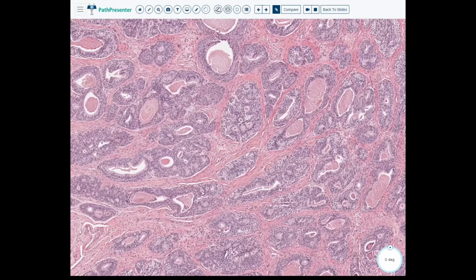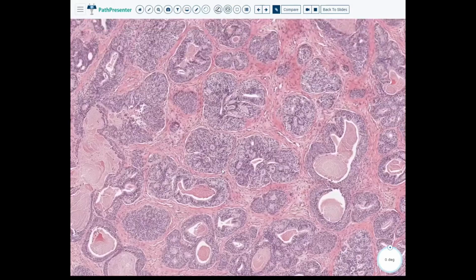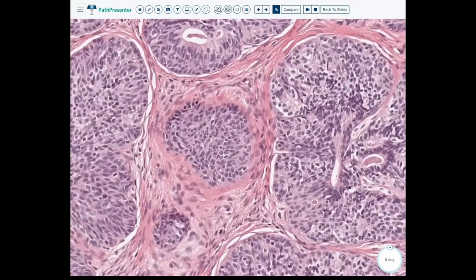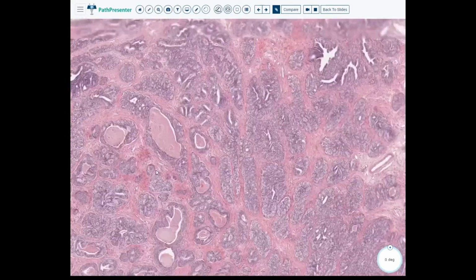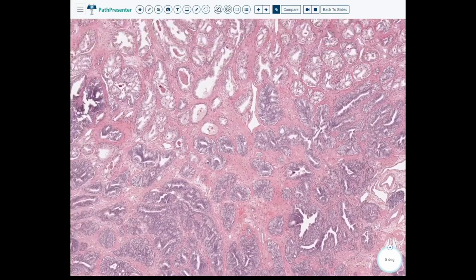So this very blue appearance, that's towards the basal cells. We do have some areas for sure that have intact luminal cells. Let's see, here's a good example actually. So you can see areas like this where it's a completely solid nest or solid knot of those basal type cells. So hopefully at this point, you're at least in the hyperplastic range.